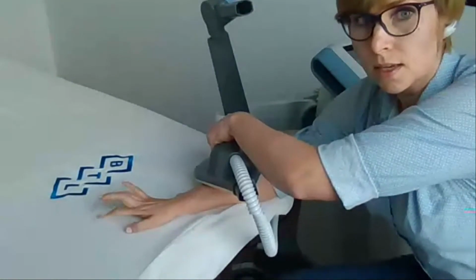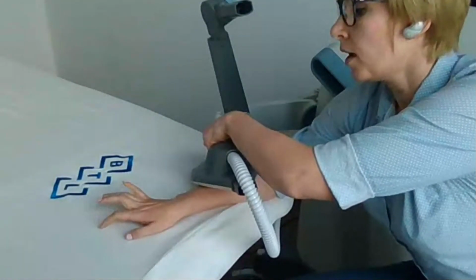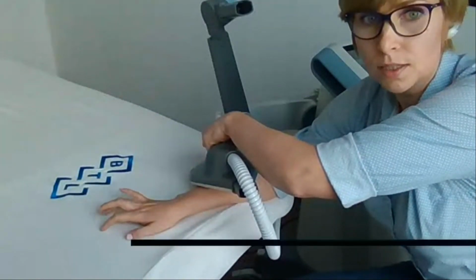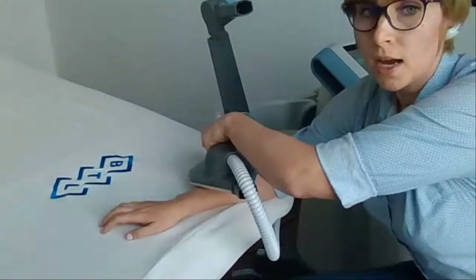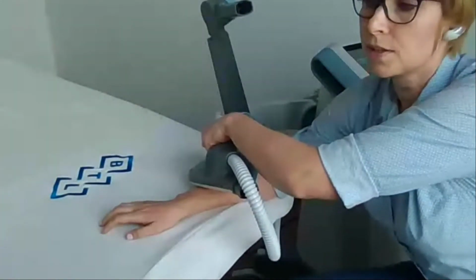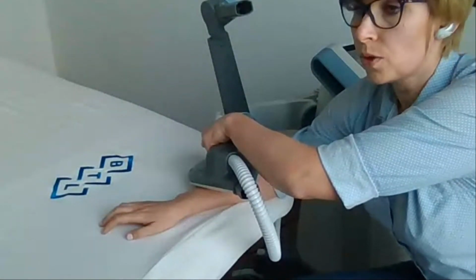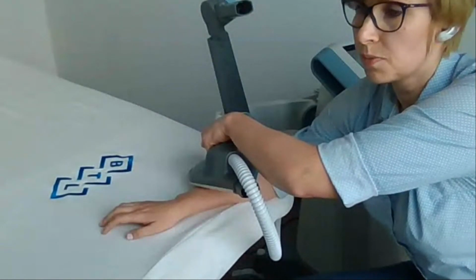So as you can see, this protocol is much more intensive, and up to the disease we want to treat, we are uploading different protocols. So we have a lot of protocols here regarding the acute or the chronic patients, regarding the trophic enhancement and circulation enhancement.